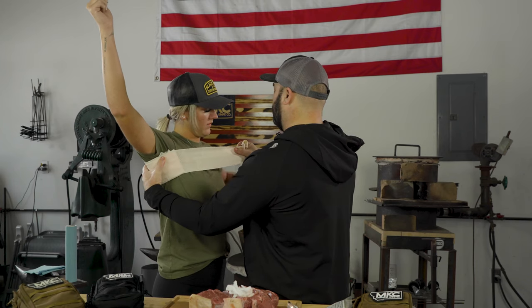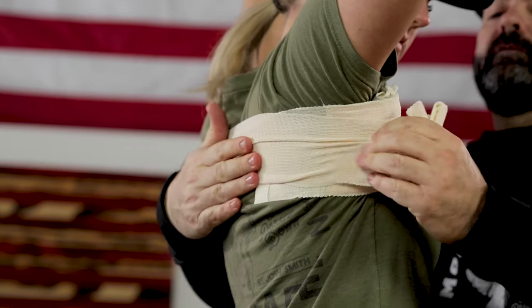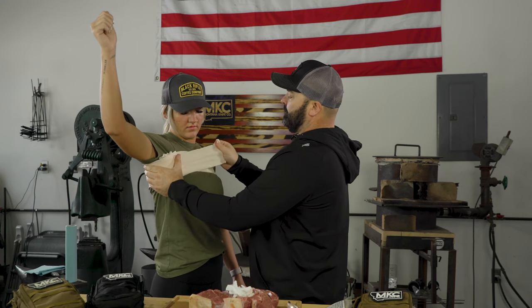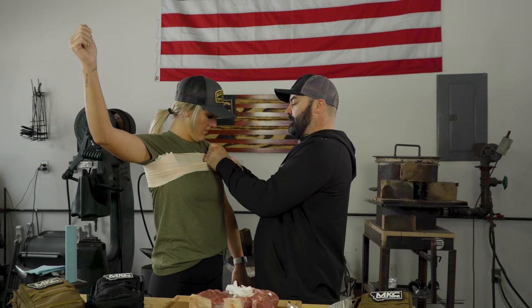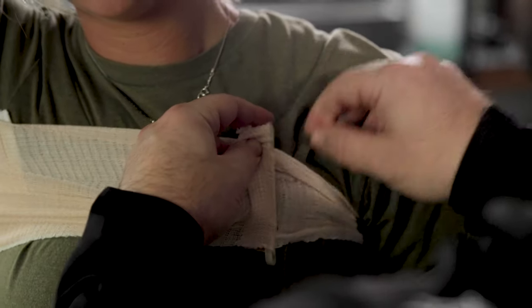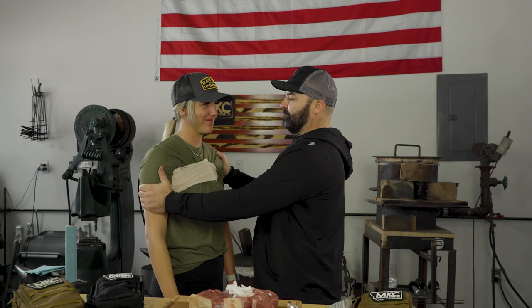I've got pressure. I'm going to wrap around, making sure that I don't lose control of the bandage, and this has a clip on it — I'm going to slip that in there and secure this with the clips. When she puts her arm down, it's going to create more pressure on the bandage. Do you feel pressure in your armpit right now? Great — then I did my job. And so did Sadie.